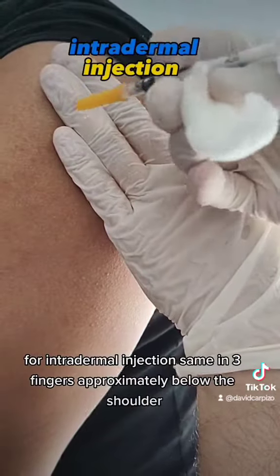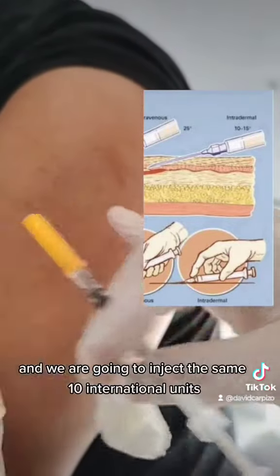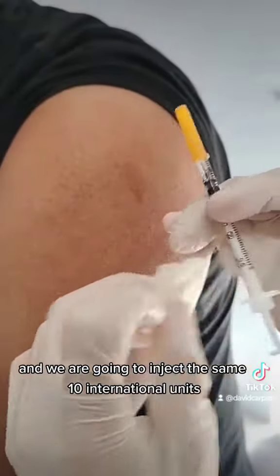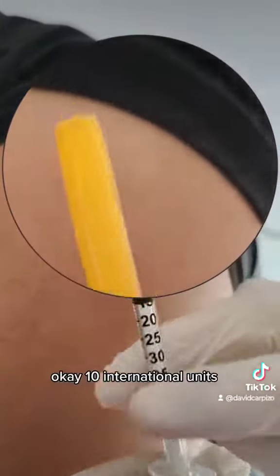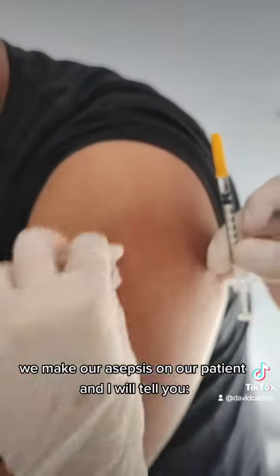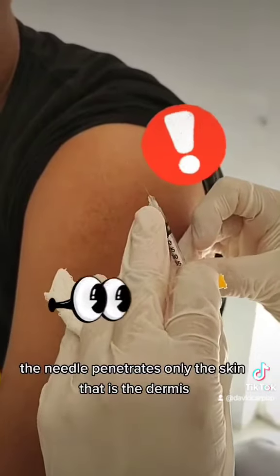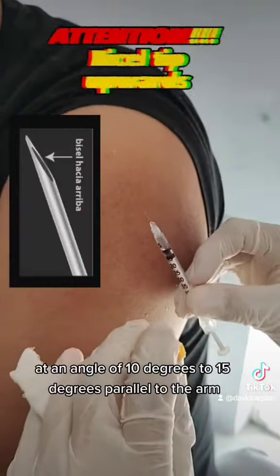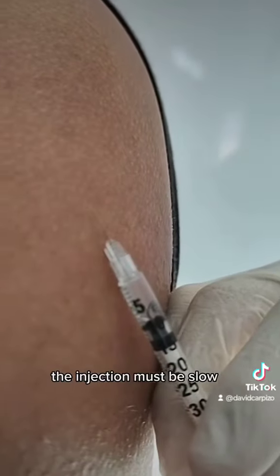For intradermal injection, same 3 fingers approximately below the shoulder, and we are going to inject the same 10 international units. We make our asepsis on our patient. The needle penetrates only the skin — that is the dermis — at an angle of 10 to 15 degrees, parallel to the arm. The injection must be slow.